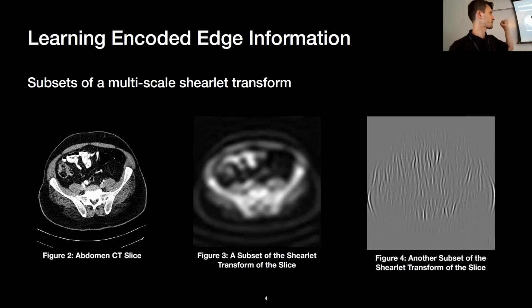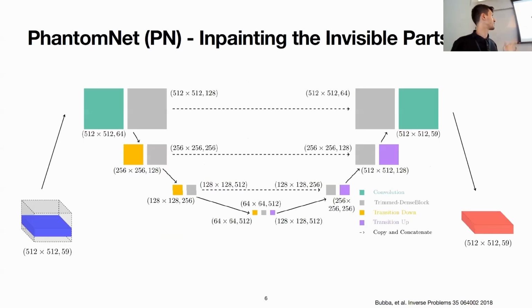These tiny patterns are what the model will learn, and not something like the actual slices, which might be contaminated by noise, different features, different parts that aren't really related to the actual slice. So that is one huge advantage of working in the Shearlet domain rather than the spatial domain. You have these things that it can actually learn that pertain to the signal and not just features that we see from the signal.